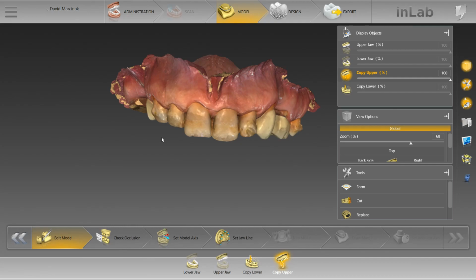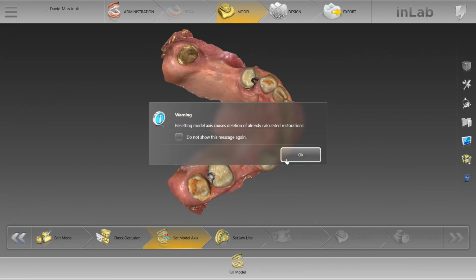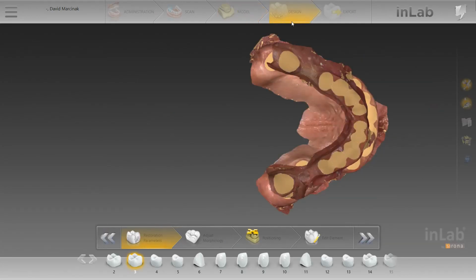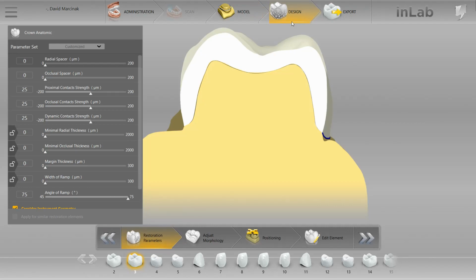I'll show you that. But one thing that you can do to orient the jaw in a proper position is when you go into set model axis, that's where you're going to take care of that. So you could see that it's kind of crooked, and once you set this properly, you can always go to, I'll show you what you can go to, but let's get into the design.